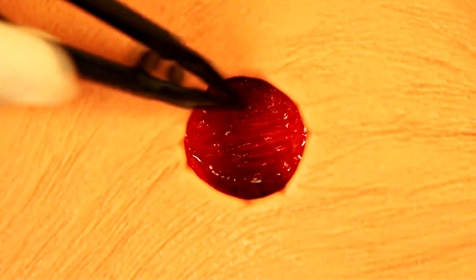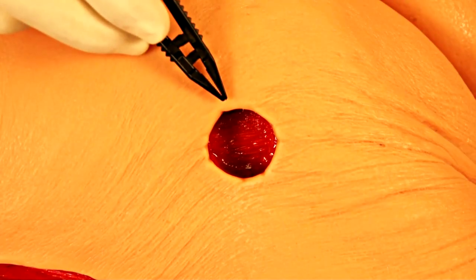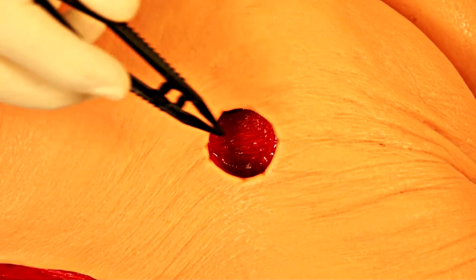This wound has no evidence of necrotic tissue and is beginning to granulate. This would be an indication for negative pressure therapy, which would be used to promote wound healing by reducing edema in the surrounding wound bed as well as removing exudate and other fluids present in the wound. There is no evidence of necrotic eschar or active infection, so this makes it a fairly straightforward application of a negative pressure dressing.